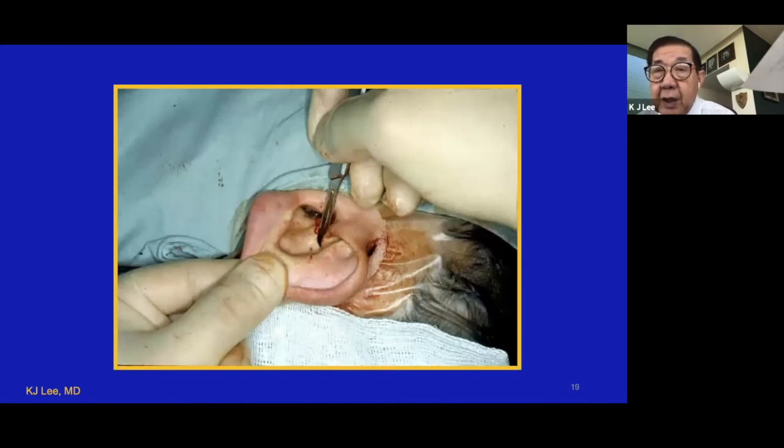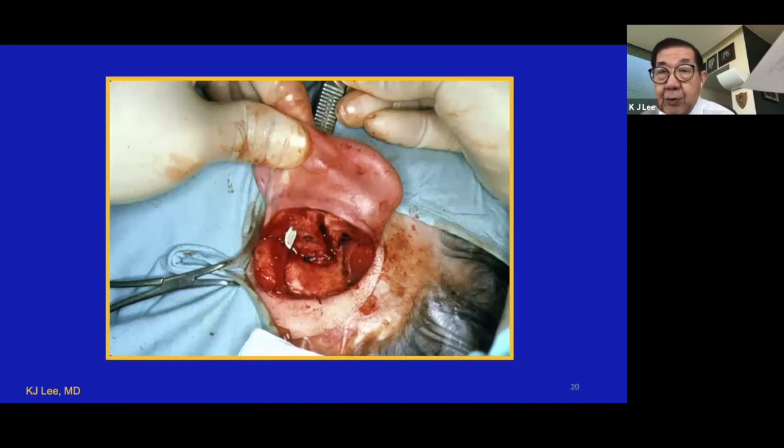Now you make an incision from where you make this circular round knife incision and bring it out towards the concha and flare out superiorly, and the other incision inferiorly to have a very wide base, vascularized flap, like a forehead flap. Here is a concha flap. Next. Now you can see the incision, okay? Superior incision, inferior incision, and the scalpel blade showing. Next.